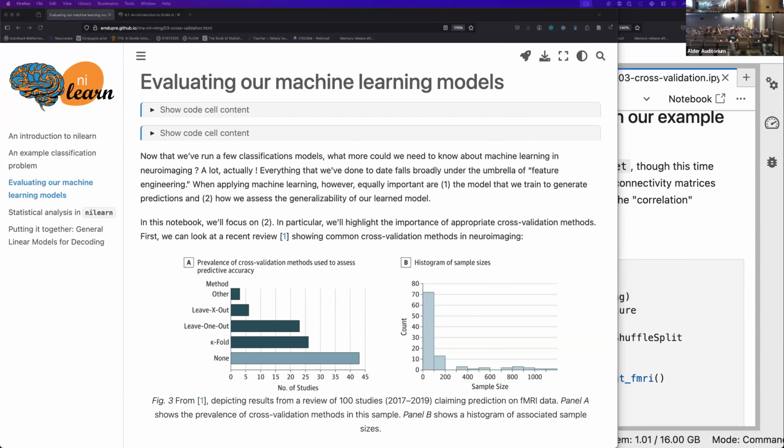Okay. My question is, earlier it said when we're using the mask, there's an option of using like clustering, like union clustering or something like that. And so I have 2 questions. One, is there an example of doing that with Nilearn? And then also, what are the advantages and disadvantages of using like a clustering algorithm as opposed to an atlas? Sorry, I missed the very last word. A clustering algorithm as opposed to what? As opposed to an atlas. An atlas. Thank you. Okay.